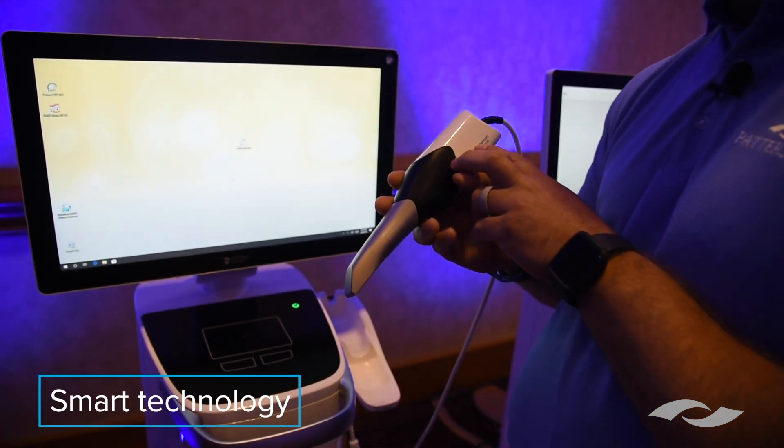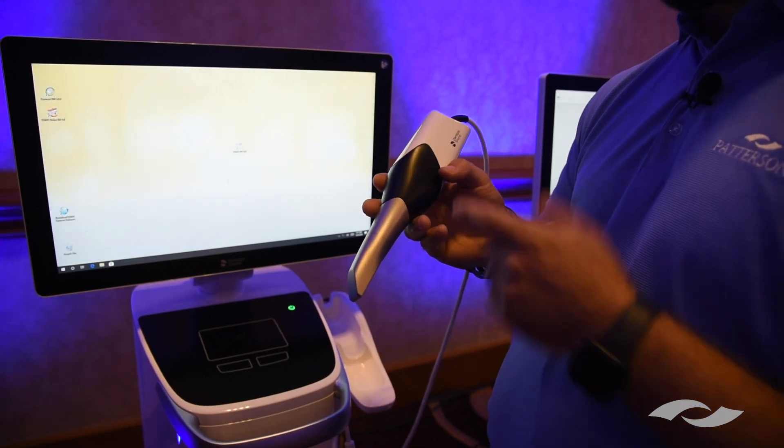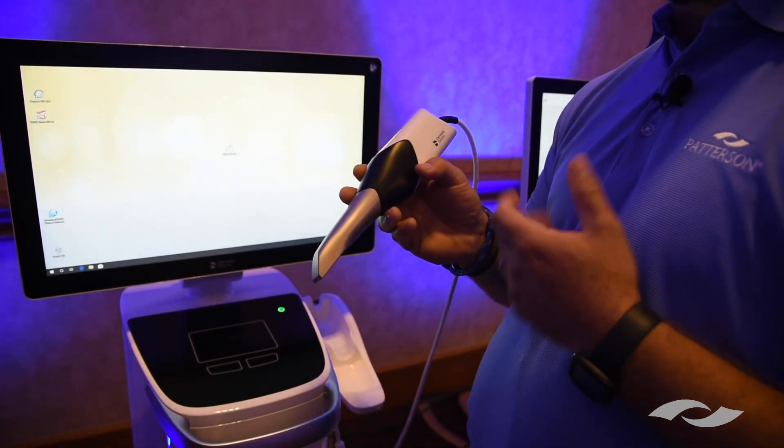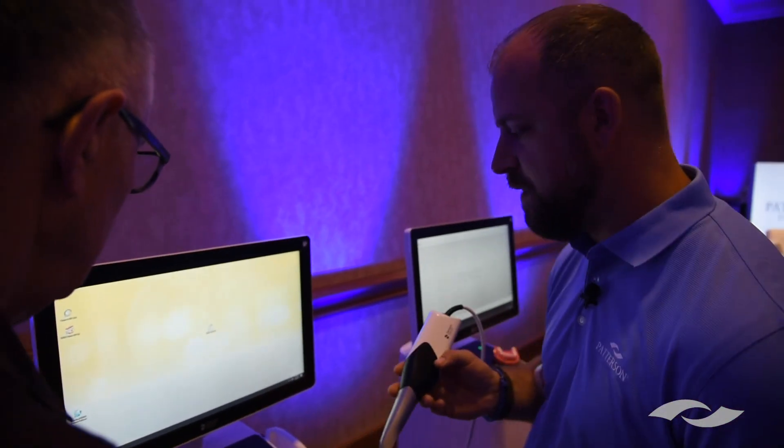It has smart technology built in that functions like artifact reduction. As you're scanning, when something like the patient's tongue gets in the way, the software within the camera recognizes that it doesn't belong there and won't capture it. It can do similar things with blood — if you scan the prep and it starts to seep a little bit, it'll recognize that and you can pull the camera out and let it re-edit that back out for you. No other camera on the market does that.